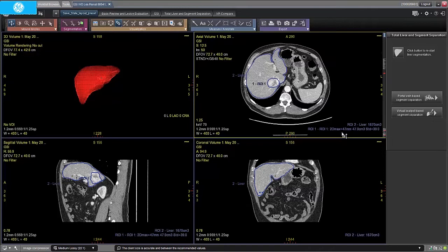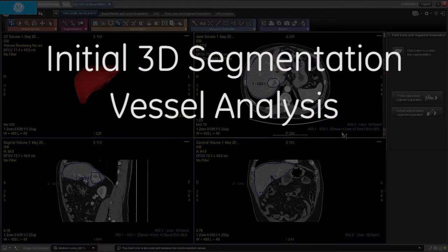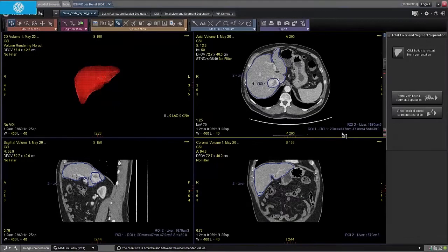Hello. We will continue with the presentation of the features of Hepathec VCAR software. Hepathec VCAR is a CT image analysis software designed to assist the user in providing initial 3D segmentation, vessel analysis, visualization and quantitative analysis of liver anatomy. In this video we will present the segment separation features of Hepathec VCAR. We will continue from the point where we stopped in the prior tutorial video. For more information about the previous steps, please refer to Hepathec VCAR Part 1.